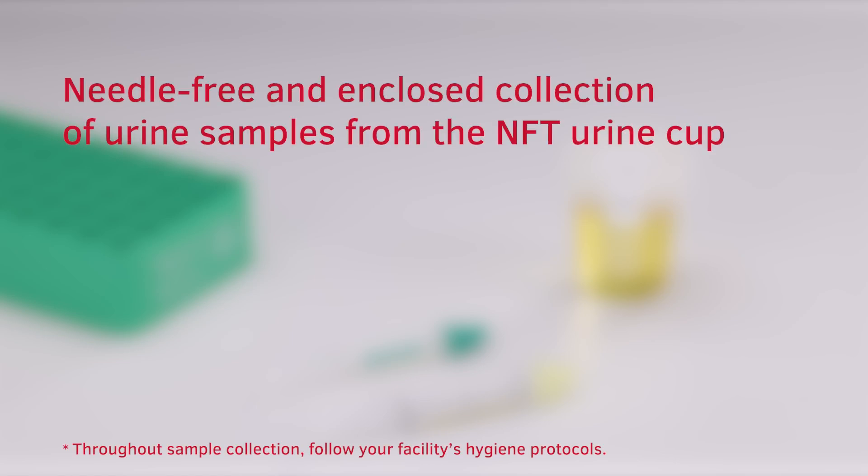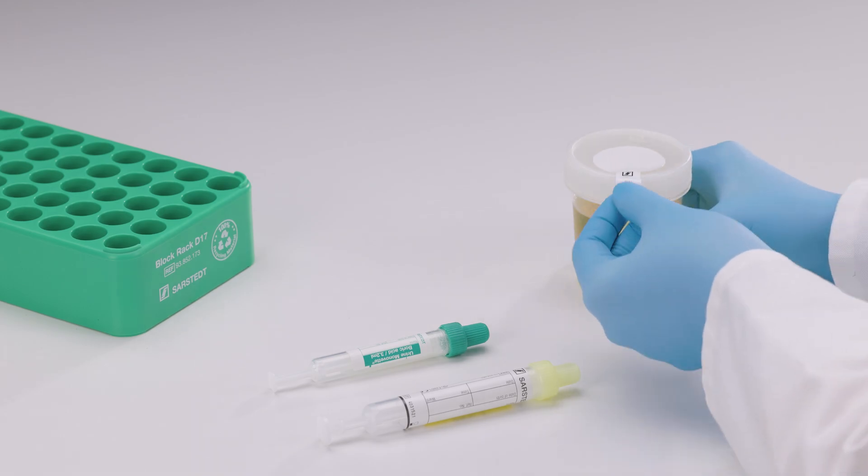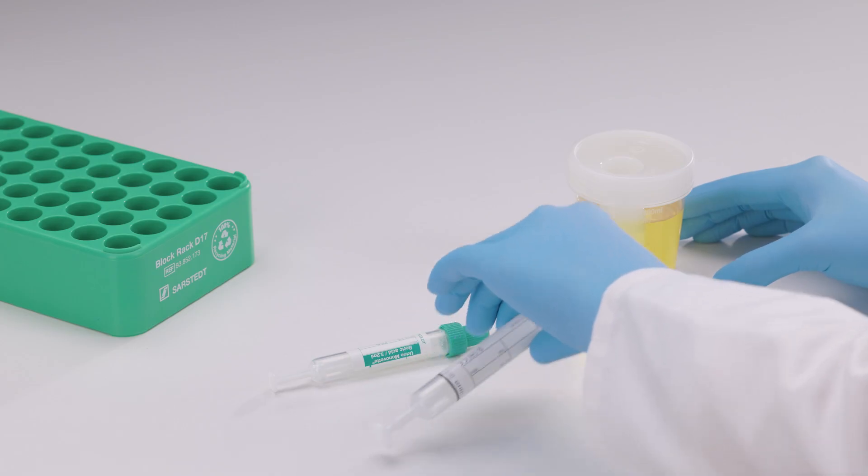Needle-free and enclosed collection of urine samples from the NFT urine cup. After receiving the sample in the NFT urine cup, peel off the safety label from the lid. Ensure that the NFT urine cup lid is tightly closed to prevent spillage.